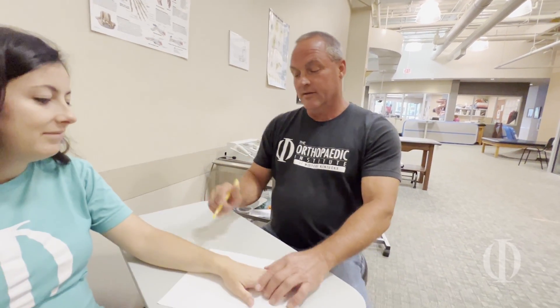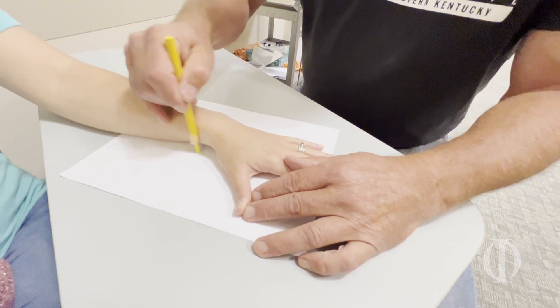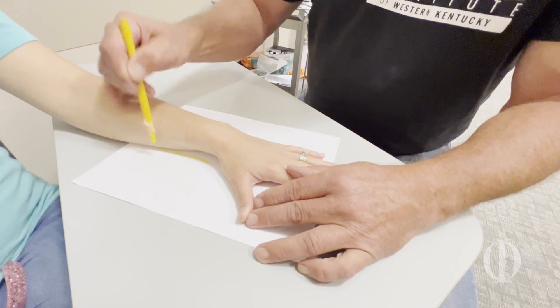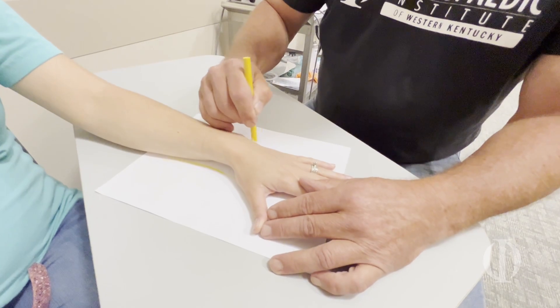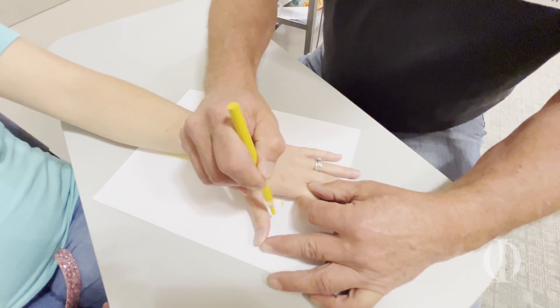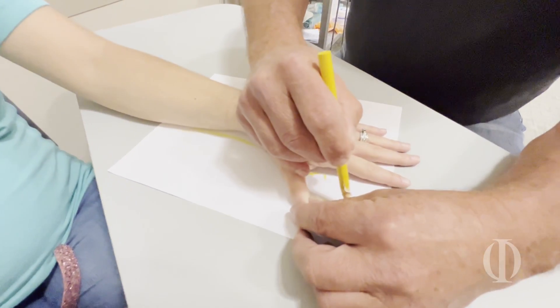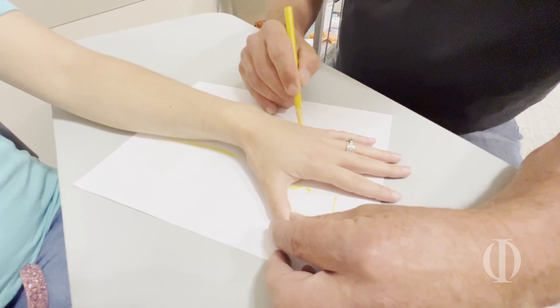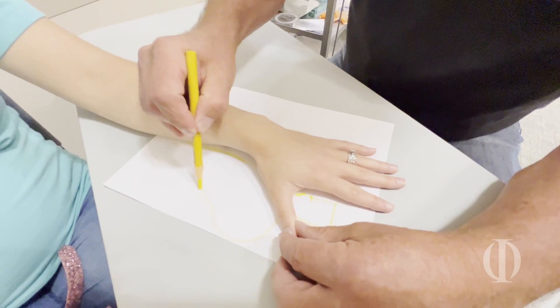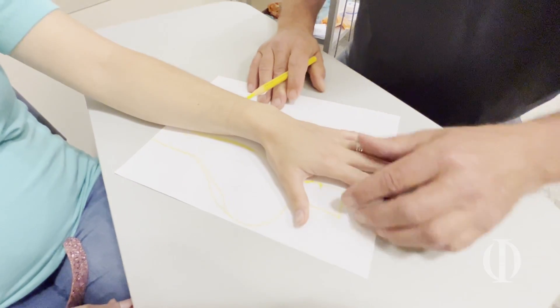First of all, we're going to make a template by tracing around their hand. We're going to come up the forearm about two-thirds of the way, up to their distal palmar crease, and I'm going to mark at the thumb IP joint and make this shape for my splint. And there's our template.